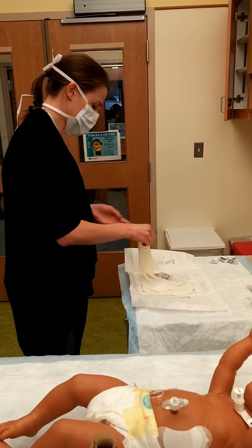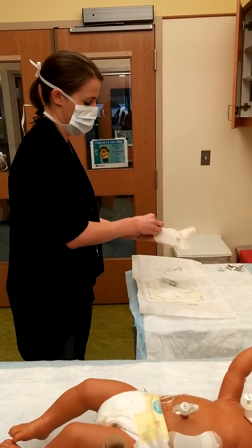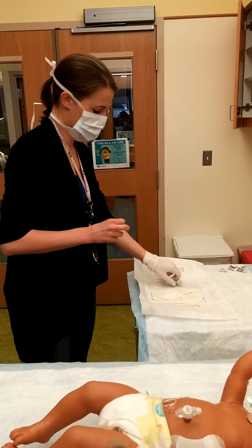Then find your sterile gloves and don them.